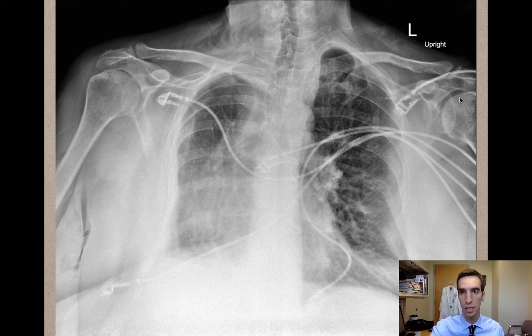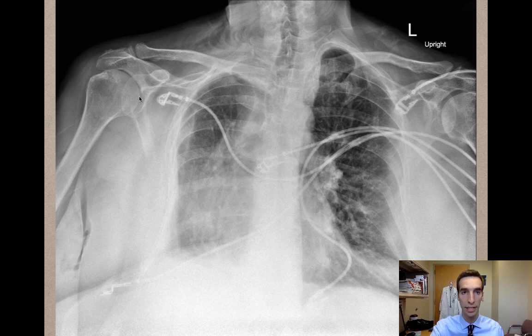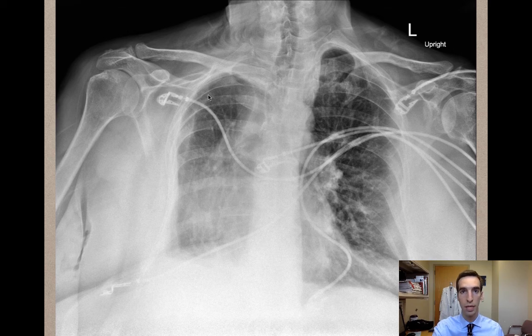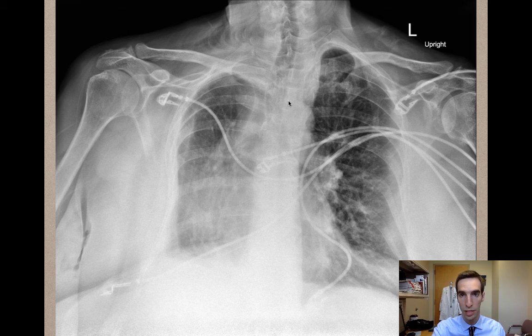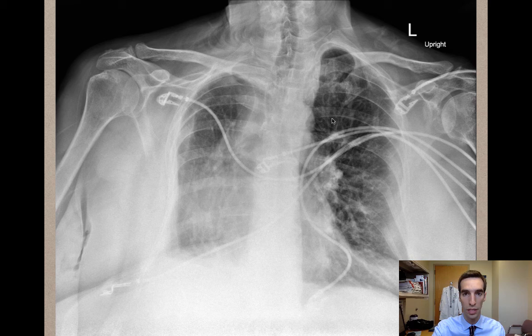Also, the joint space from left shoulder to right shoulder is a little narrower on the right side, meaning that there might be some osteoarthritic changes in the right shoulder joint — but it might again be that the patient is tilted. Looking at the ribs, you can see that they are smooth, and there isn't any costochondral joint inflammation.